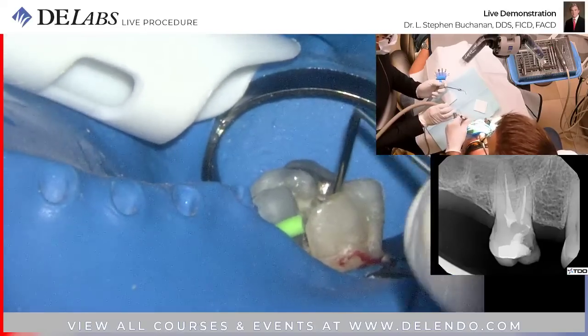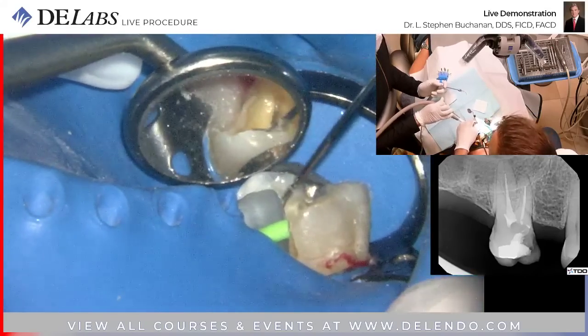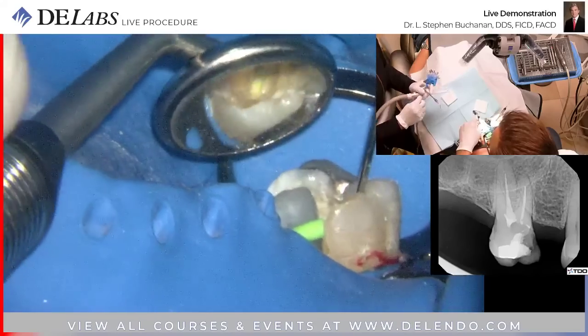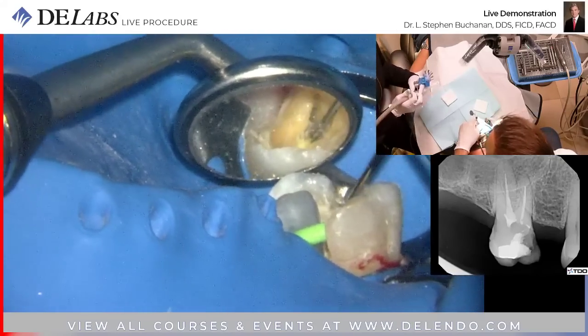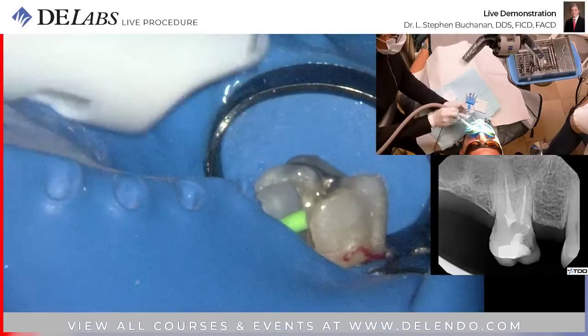Okay, this sponge. This place for the previous dentist. And I have images of him with Carrie's disclosing solution on here, so we know for sure that it's had the decay removed.